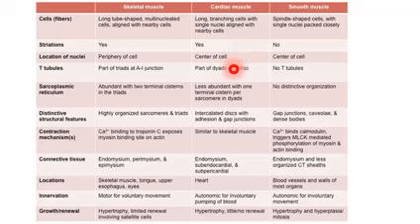And we may see, as we have stated, that there is a triad in the T tubules of the skeletal muscle. Here we have a dyad of the disc. So we do have also the sarcomere.